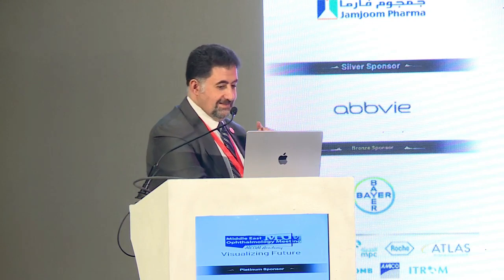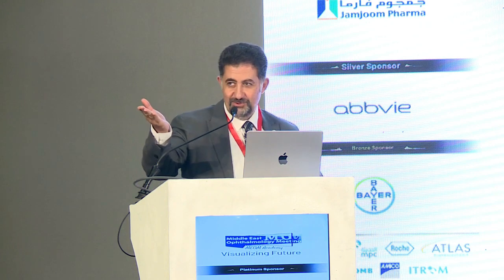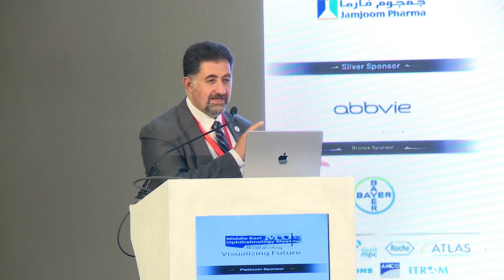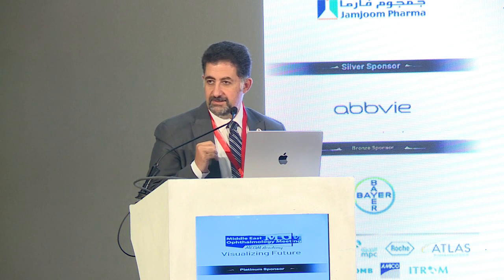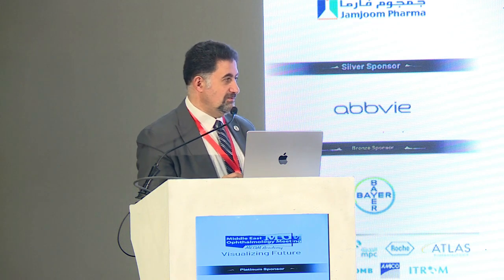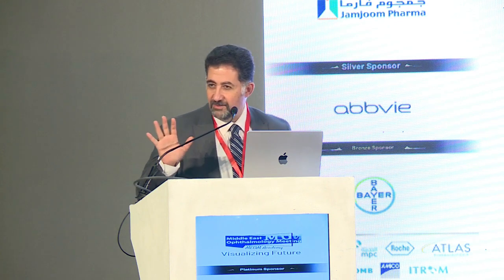Do you think, Dr. Ashraf, if the patient gets better vision with the hard contact lens, he will have the same vision with ICL? Yeah, this was the aim of my question to Dr. Ahmed. So I will take time from him, not from your side. Yes, please. If the hard contact lens fits well and the patient is going to see good, then the retinal image will be okay, so I'm going for ICL. But if he tried the hard contact lens and the vision was not improved, he is not going to improve even with the ICL. Yeah, this is the aim of my question.